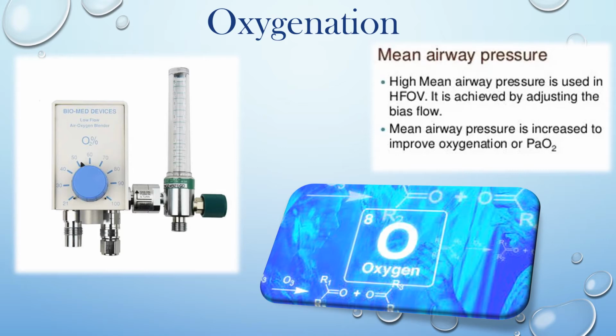Although the lung must be recruited, this must be done conservatively to avoid overdistension. Alveolar atelectasis or overdistension can result in an increase in pulmonary vascular resistance. To initially introduce mean airway pressure, it should be set 3 to 5 centimeters of water pressure above the corresponding mean airway pressure used prior during conventional ventilation. Mean airway pressure normal ranges are 25 to 30 centimeters of water pressure.